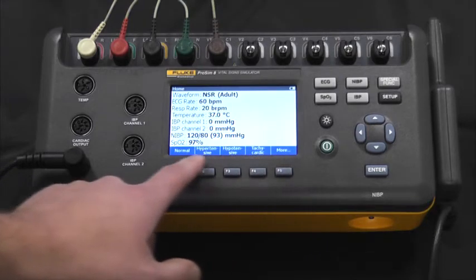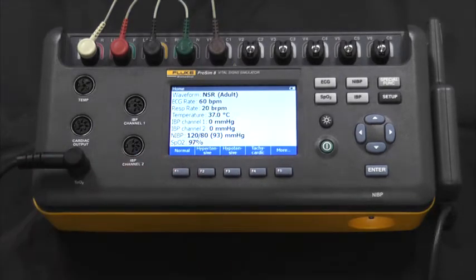As we look at the bottom of the device, we see various patient disease states and chronic conditions. These are exactly as they would appear in a patient. All physiological parameters are correlated so that they reflect the patient to the patient monitor.